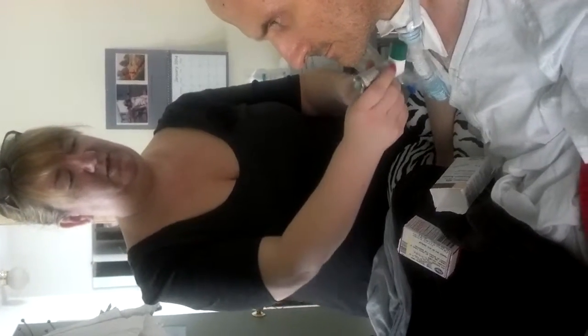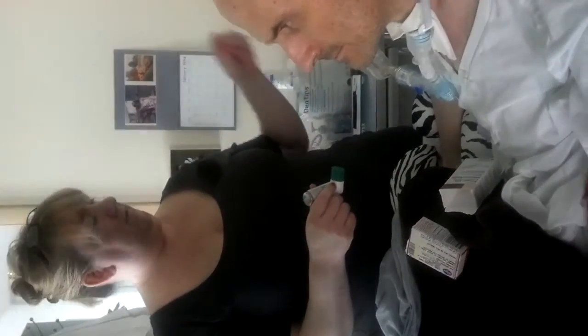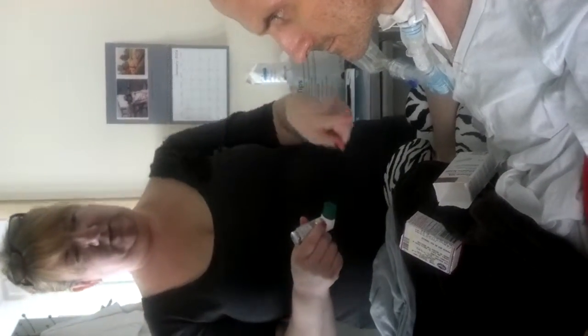So, if you disconnect here and try to do it that way, he's still not breathing in, right? So, the only thing breathing in for him is this ventilator in the vent circuit. So, now we have to figure out how do you get it in the vent circuit.